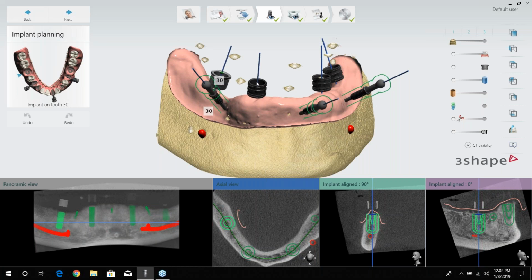All right, last question. What is the proper distance from sleeve to implant, and how does that affect the surgeon's technique in drilling and placing? That's going to depend on the implant manufacturer's recommendations, because they're all going to have a different theory or different research behind what they believe the appropriate distance of the sleeve is, and that's why they restrict the sleeve to their recommended setup or system use.